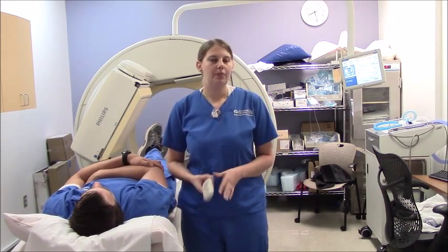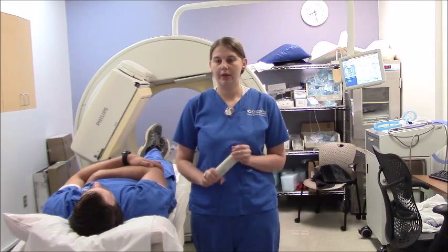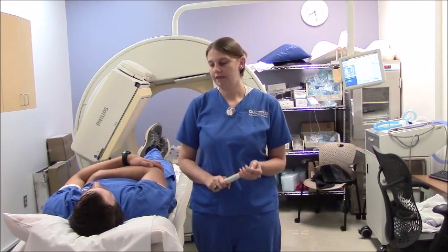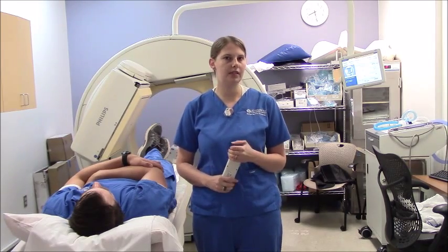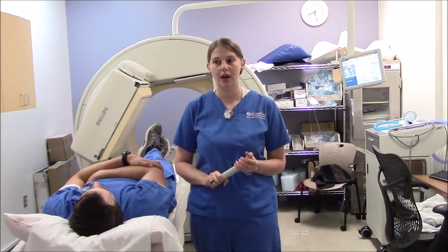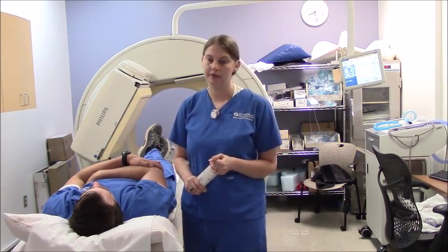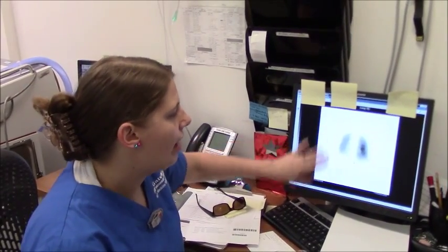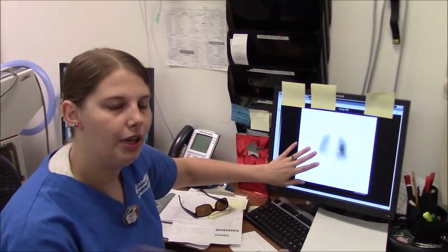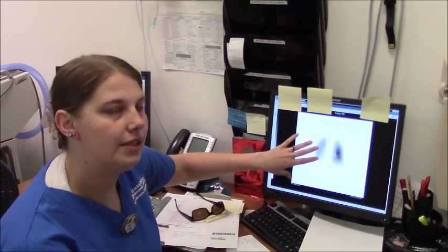Now before you let the patient go, it's important that you get your study read by a radiologist first. If this patient does turn out to have a pulmonary embolism, that's not somebody that we want to let go without treating first. Okay, so this is a raw image. This is our anterior view. So when you're putting the patient in to position them, this is what you might see on the P-scope.